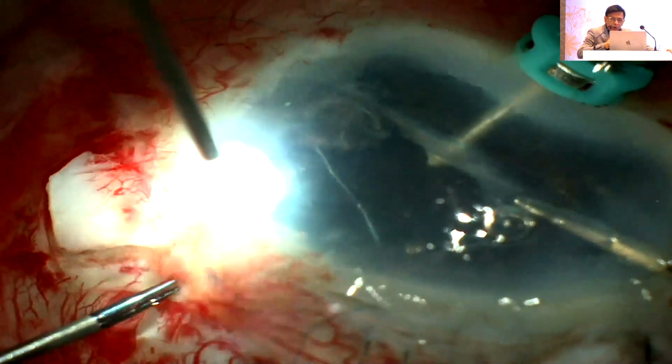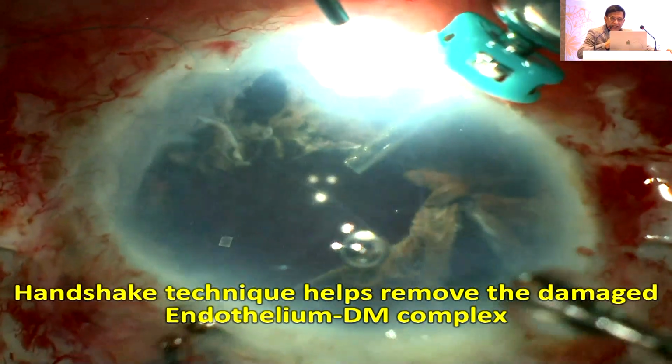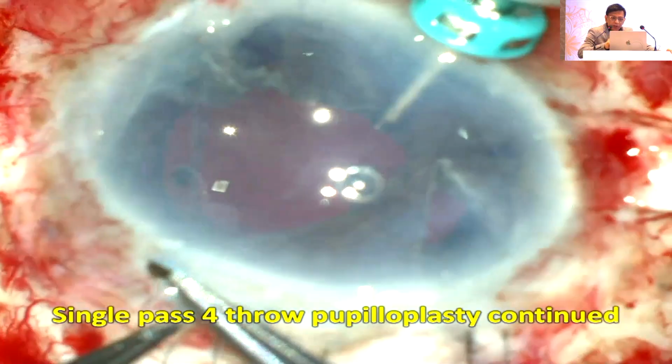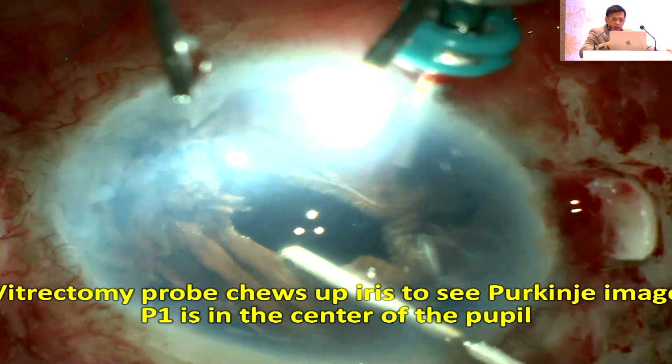Remember, this patient has come all the way from the Philippines to me. I have only one chance. Obviously, he cannot go and come back. A top ophthalmologist from there had referred this case to me. Now I continue to do this surgery.